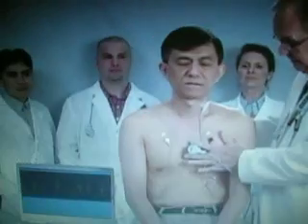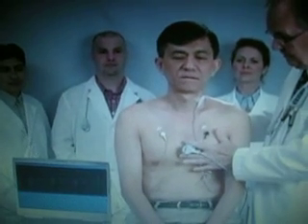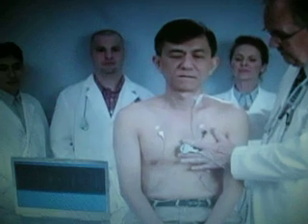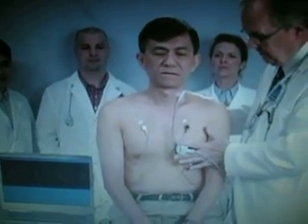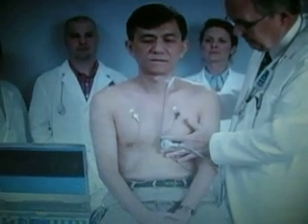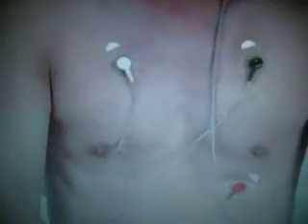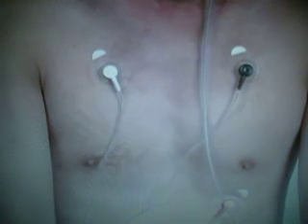The CardioSim has a powerful patient auscultation system that allows students or teachers to record, store, manipulate, and play back sounds from individual patients for use either as study aids or as material for the classroom. Optional patient inputs include a 3-lead patient ECG and pulse recording transducer.